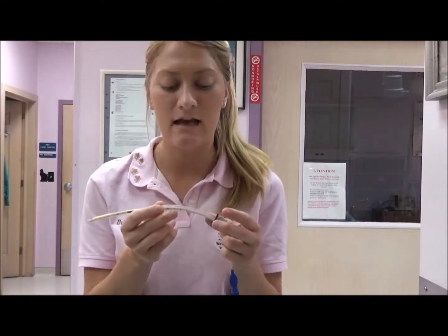An endotracheal tube is used to conduct the anesthetic gas directly and efficiently from the breathing machine to the patient's trachea. They also work by helping to maintain an open airway. They reduce risk of aspiration. They reduce anatomic dead space, and they also allow for manual ventilation if need be.